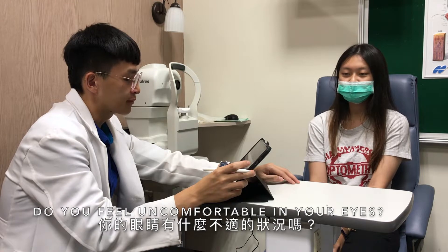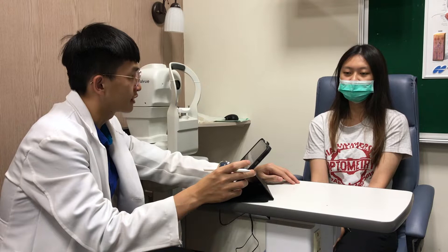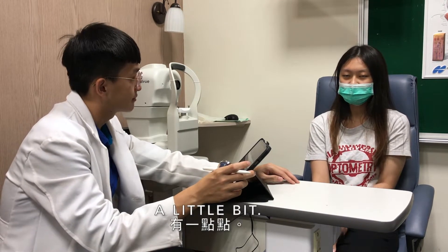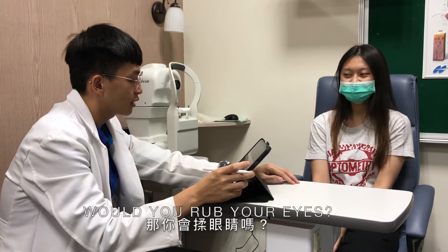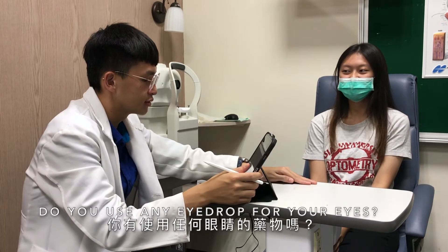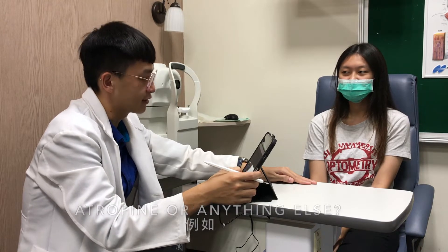Do you feel any discomfort in your eyes such as puffy, itchy, pain, or dry? Sometimes I feel itchy. Do you have any allergies? A little bit. Would you rub your eyes? Yes. Do you use any eye drops such as atropine or anything else? No.